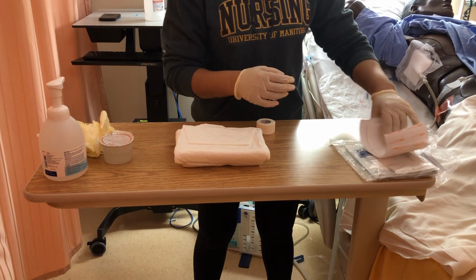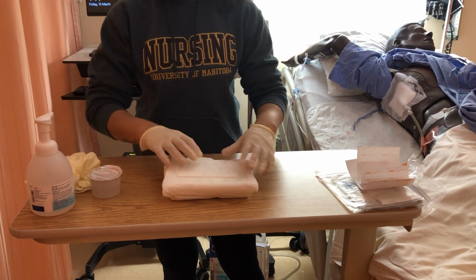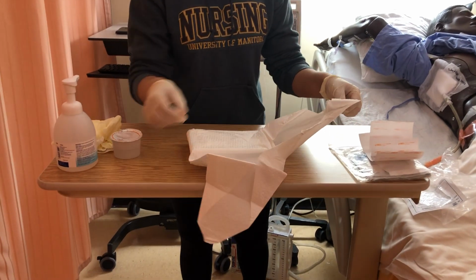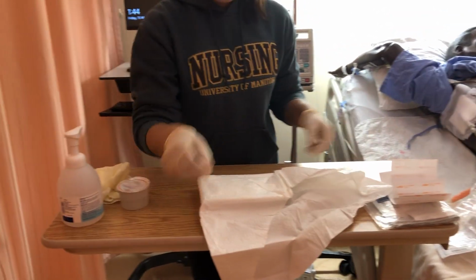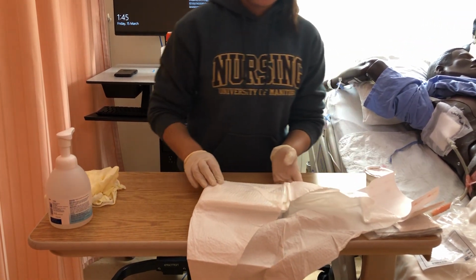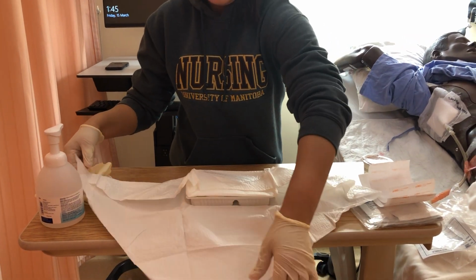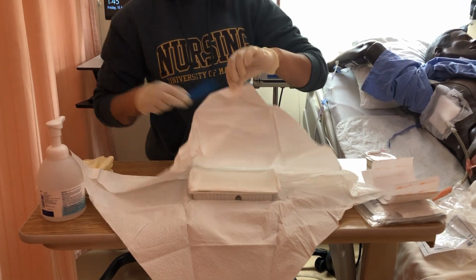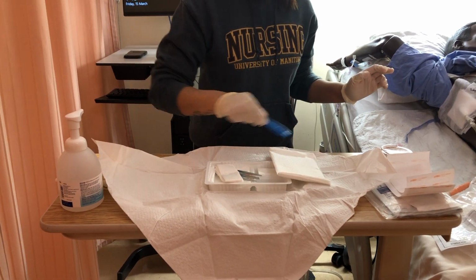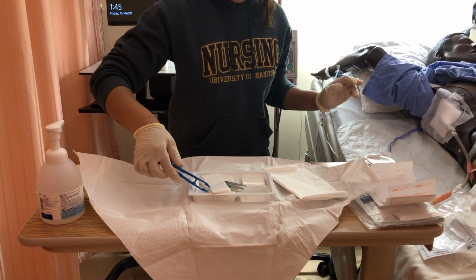Just gonna put this to the side for now. I have all my supplies here. Okay, so I'm going to open up my tray. And then sterile water to clean up my tray, garbage can. Set that up. I'm going to be a little bit more careful. There we go. So that's set up at the bedside, that's okay. Just taking a look at his oxygen saturation, and it is still good. So now we're going to check the forceps. So I'll just put the drape to the side for now. I'm going to set up my garbage.